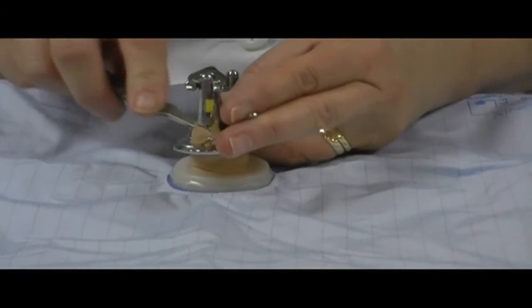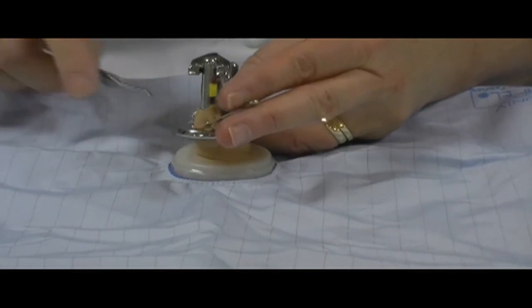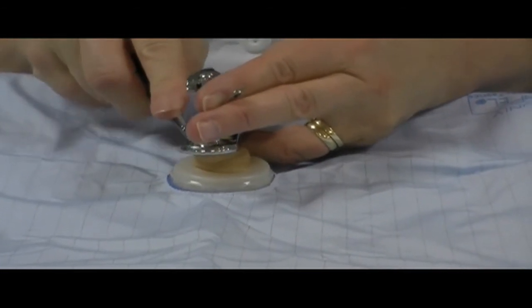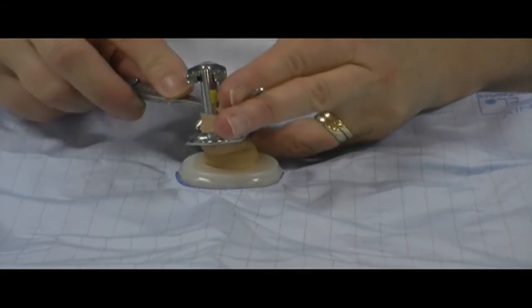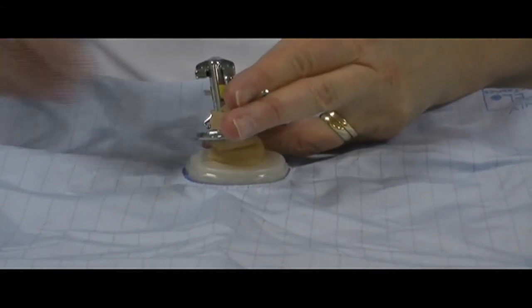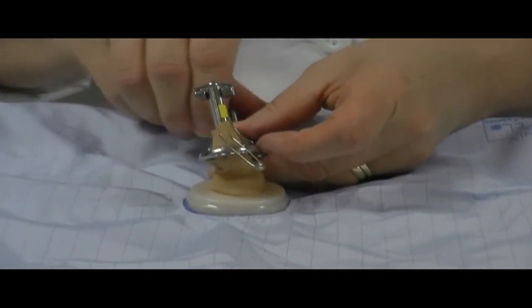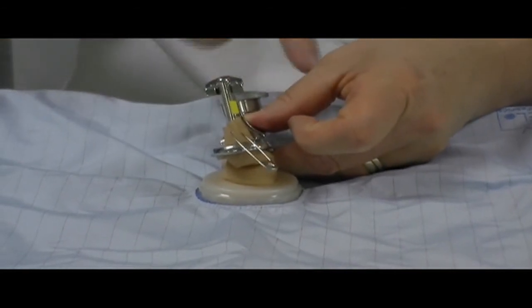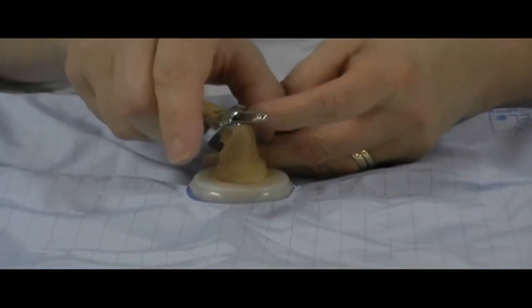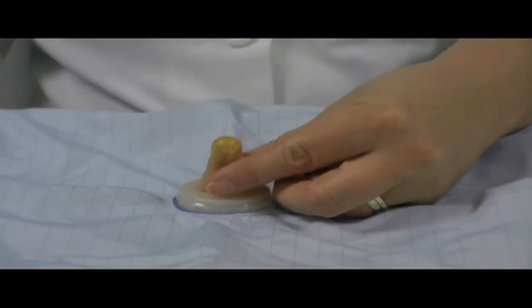On this simulation model, your scalpel blades do become dull quite quickly, so you may need to replace those. Many institutions will use disposable scalpels, and you want to be sure that that occurs as well. The foreskin is removed, the clamp is then released, and the Gomco bell is then removed as well, and the circumcision has been completed.